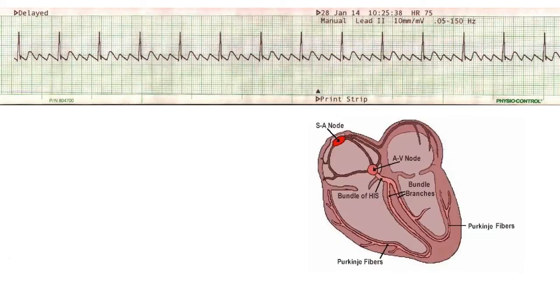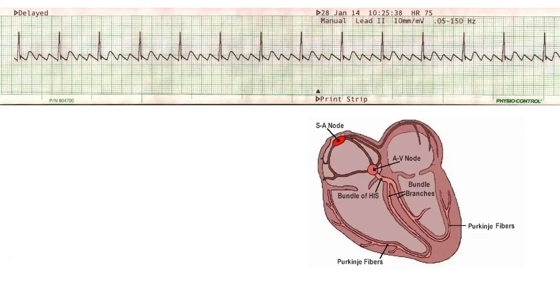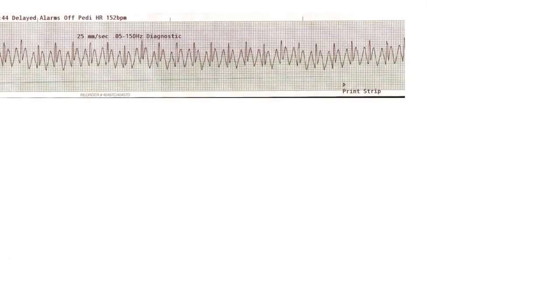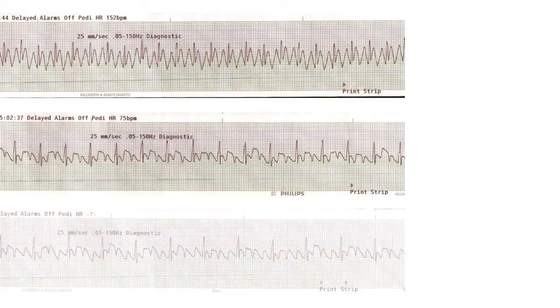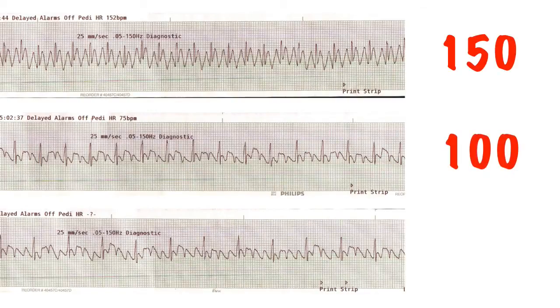A saw-toothed shape to the P wave may indicate atrial flutter. In atrial flutter, the SA node is firing at around 300 beats per minute. The AV node, concerned about letting so many impulses through, only lets through every other impulse, or every third, or every fourth impulse. This usually means that flutter gives fairly predictable rates of 150, 100, or 75 beats per minute.